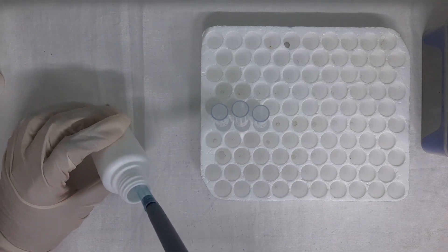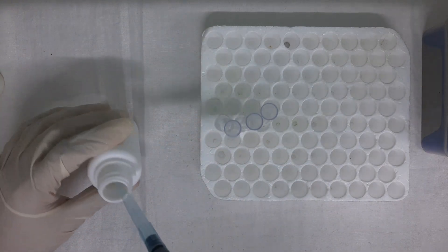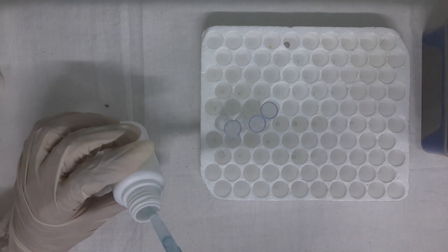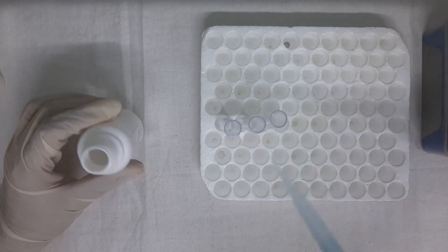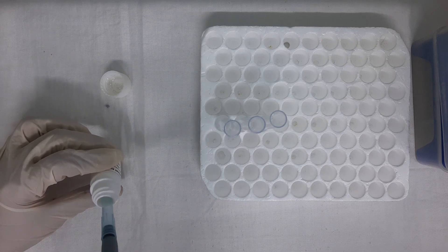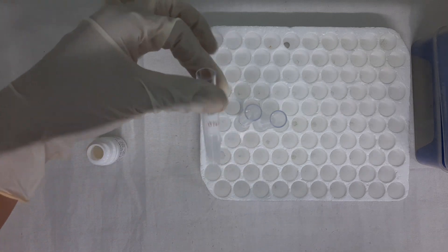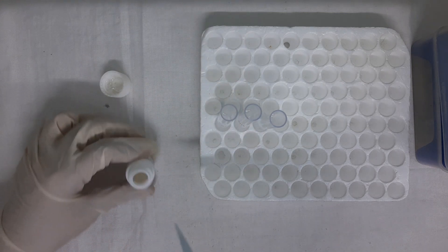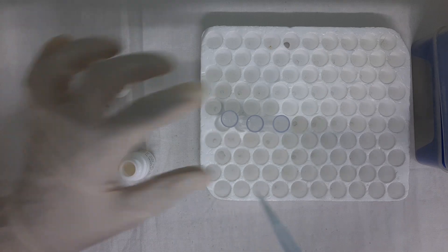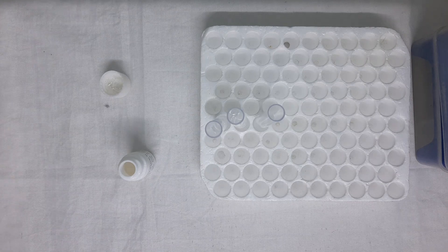As per the procedure, first we need to take 800 microlitre of Reagent 1 without any air bubble, and add this volume into all 3 tubes previously labelled for blank, calibrator, and test. After changing to a fresh tip, take 200 microlitre of Reagent 2 without any air bubble, and add to all 3 tubes which already contain 800 microlitres of Reagent 1. After adding 200 microlitres of Reagent 2, mix the components of each tube thoroughly.